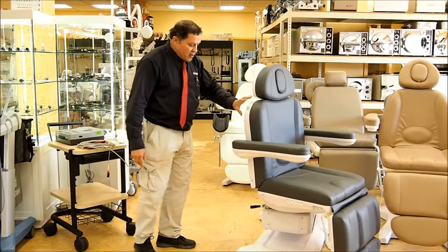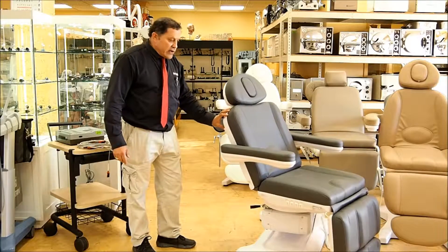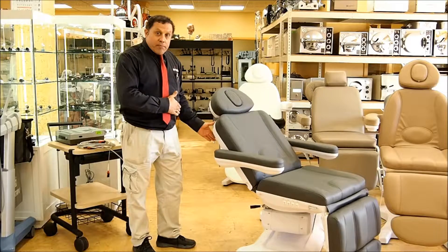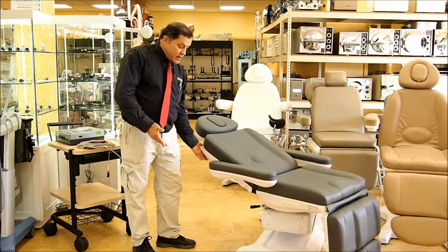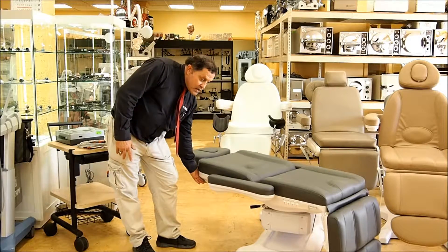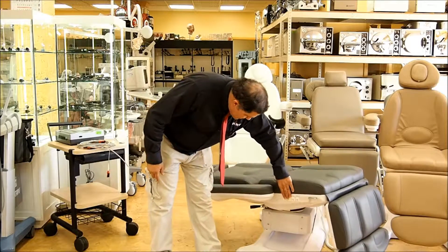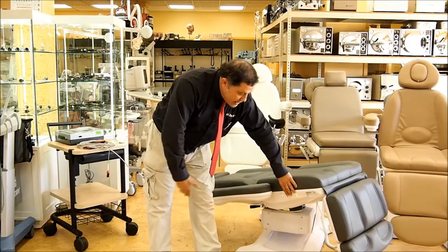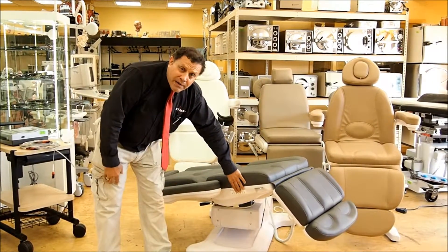This one here is programmable from the back. You have a control here — power back, power up and down, power foot. There is a control from the side, and there's your Trendelenburg. You also have a control button from the bottom.